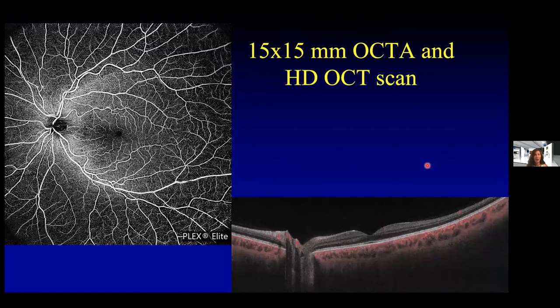All of the OCT-A machines have different protocols for imaging, and there's a huge variety of protocols available. This has become one of my more recent favorite protocols for diabetic patients. This is a 15 by 15 millimeter OCT-A scan on the left, and on the right is a high-definition structural OCT, and I find this gives me a lot of information quickly about my diabetic patients.